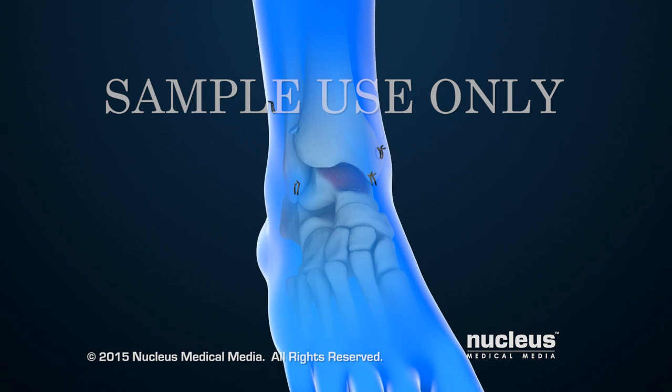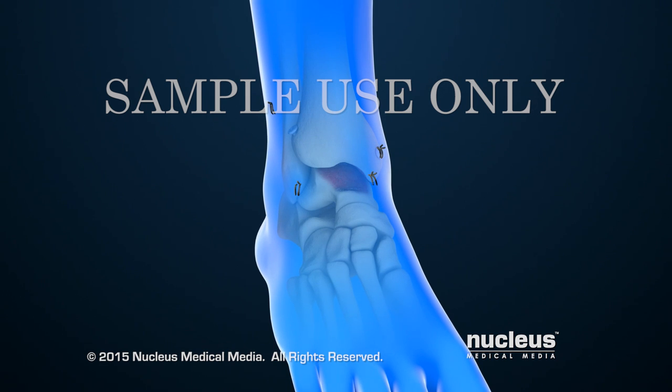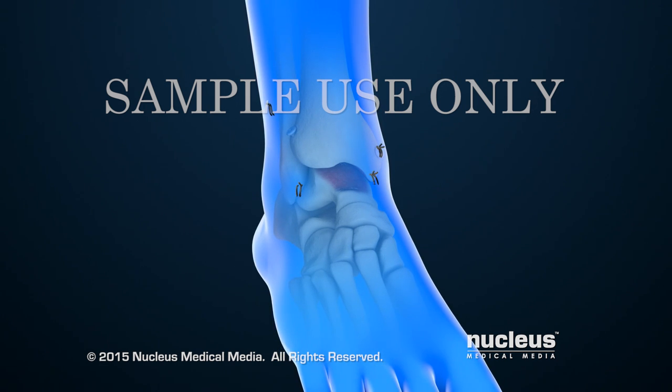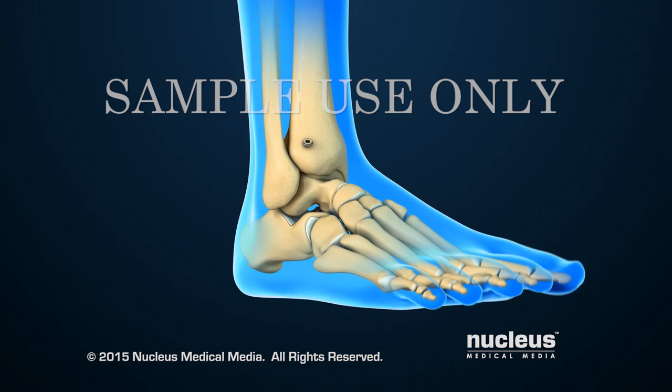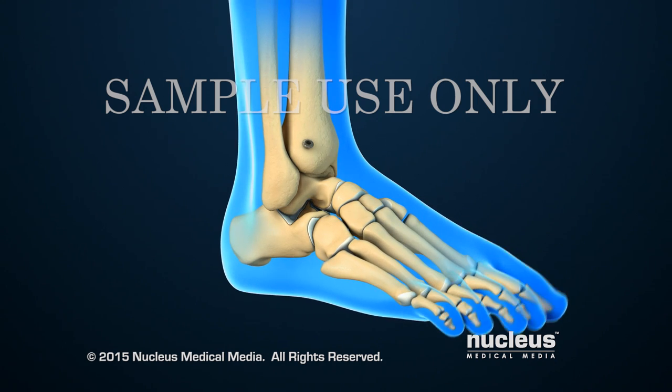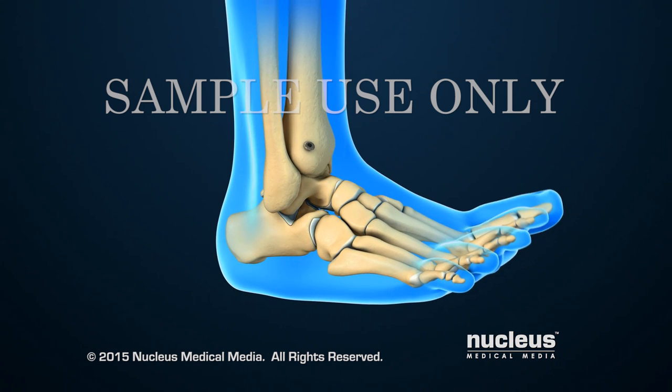Finally, the incisions will be closed with sutures. After ankle fusion, the patient will no longer be able to move the ankle joint. However, fusion removes the pain caused by arthritic surfaces rubbing together, and other joints in the foot continue to allow limited movement.